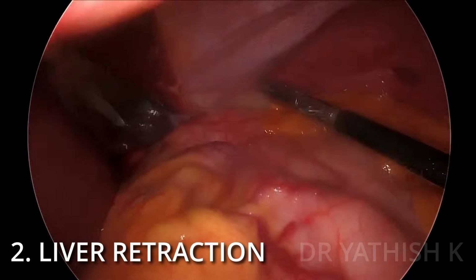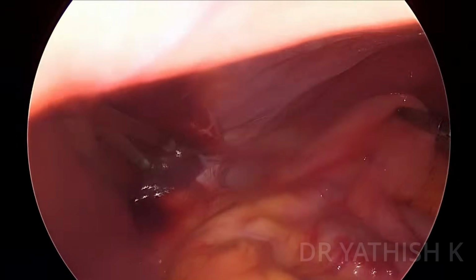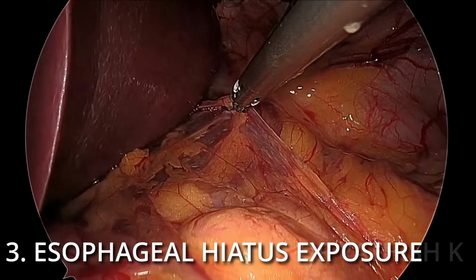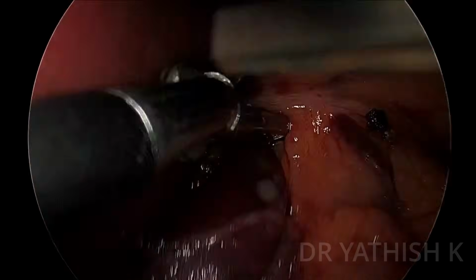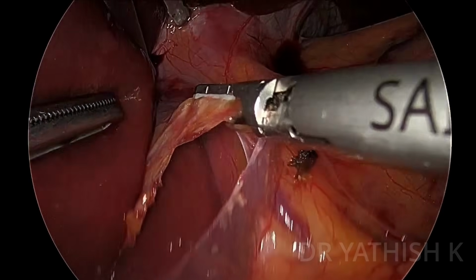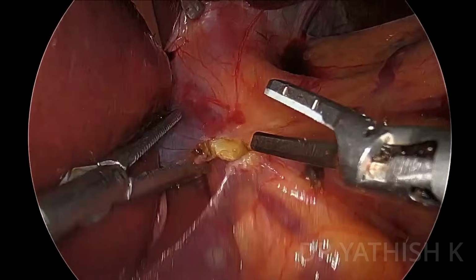First is the patient positioning. The patient is typically positioned supine with leg split, where I'll be standing in between the legs and my assistant will be to my right, with the lap stack placed right behind the left shoulder of the patient. The port placements remain the same as for standard upper GI ports. After doing a diagnostic laparoscopy, we start our surgery proper.